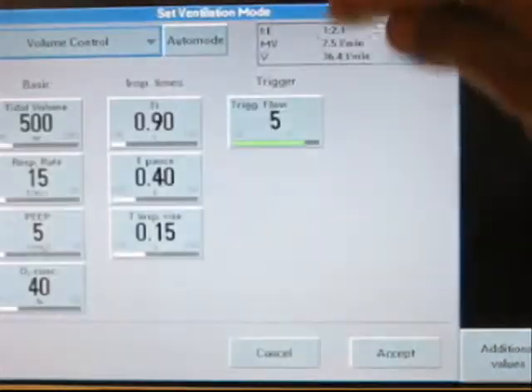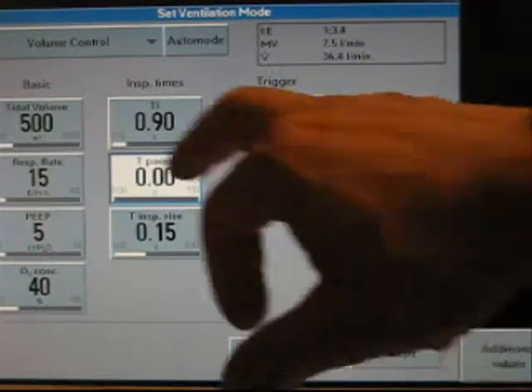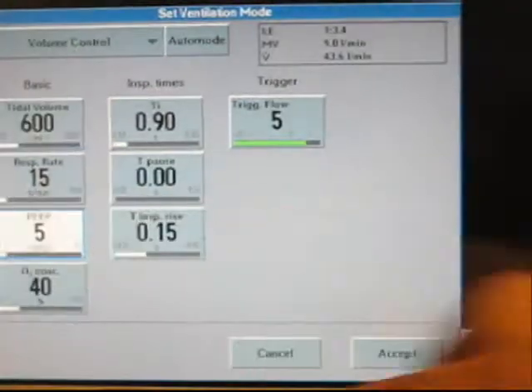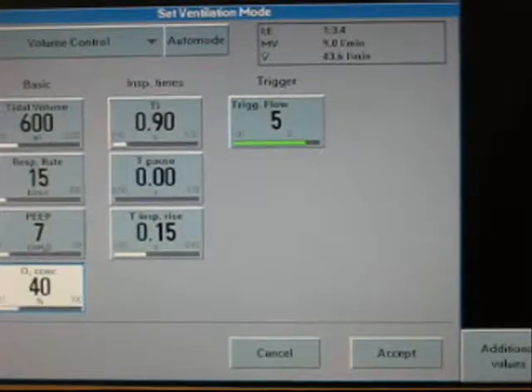Where possible, preset mechanical ventilation parameters according to the patient's ideal body weight and the issue for which they are being ventilated. This generally falls into the categories of oxygenation issues, ventilation issues, or airway maintenance issues.